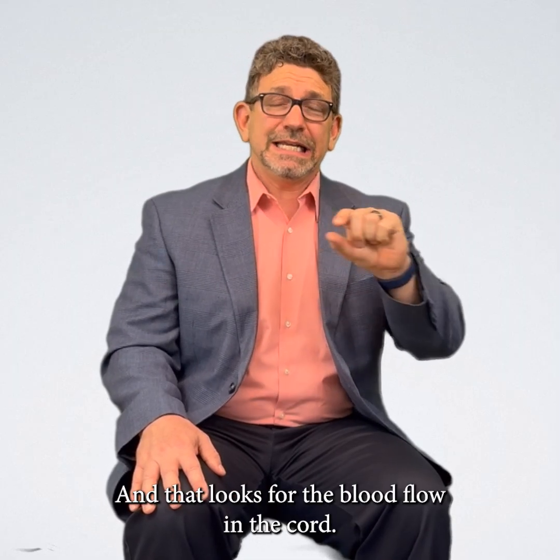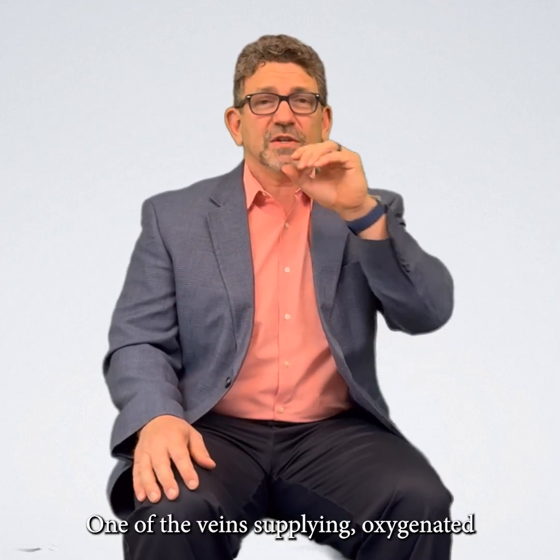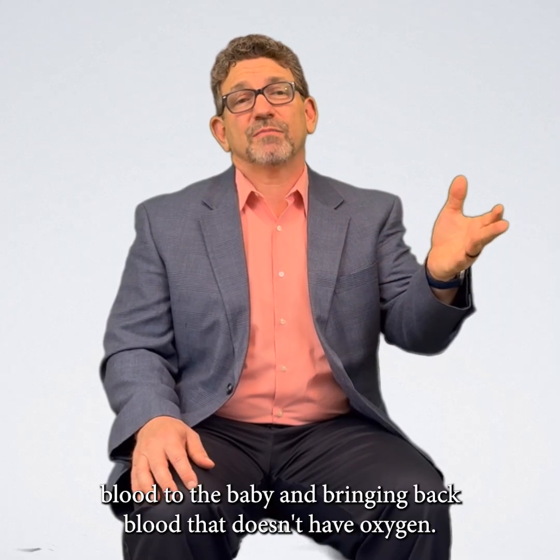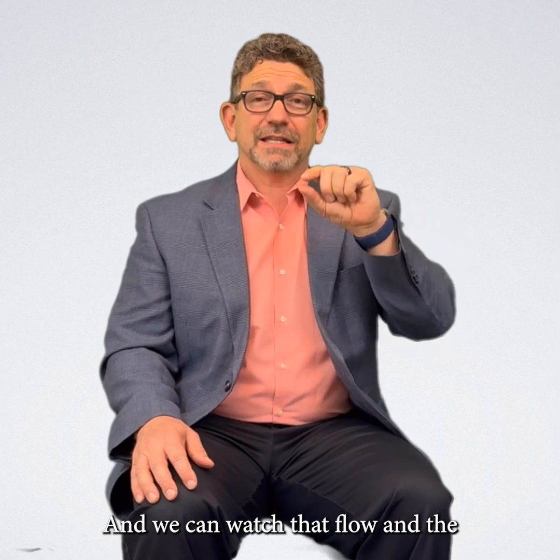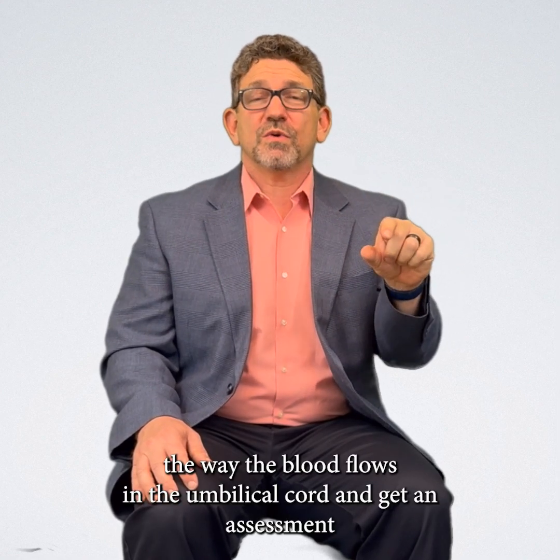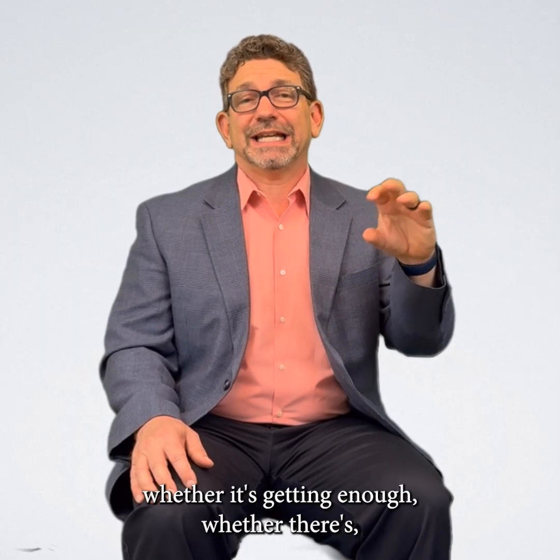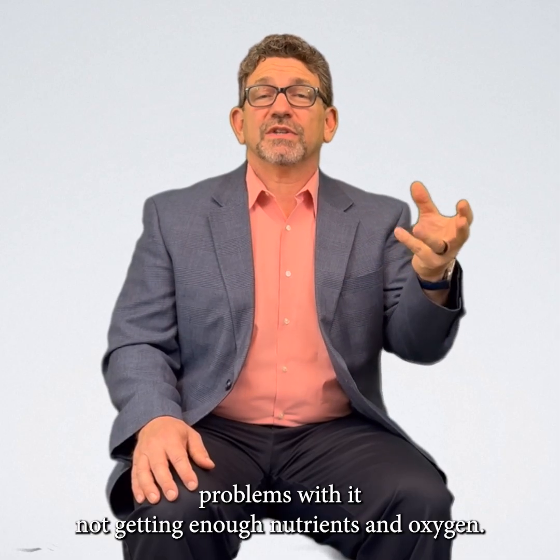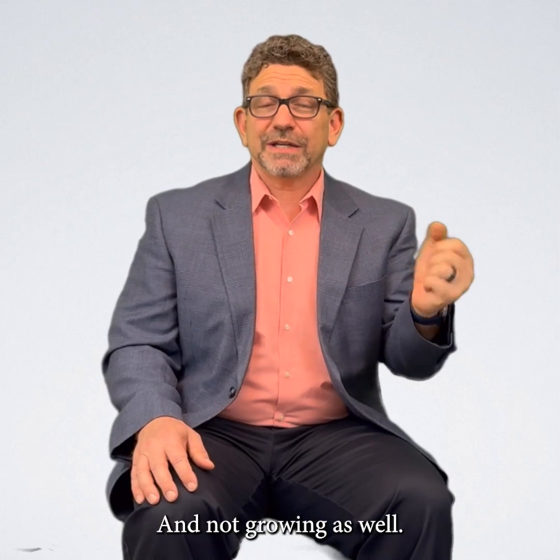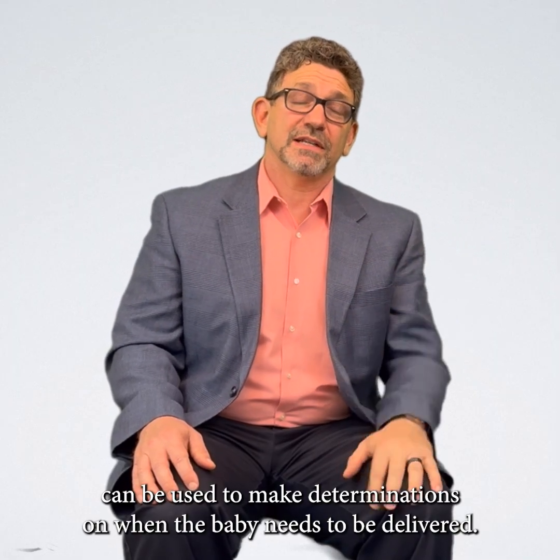Another assessment test for the baby, for the fetal well-being, is the Doppler test, and that looks for the blood flow in the cord. The blood goes in both directions in the arteries and veins, one direction in the artery, one in the vein, supplying oxygenated blood to the baby and bringing back blood that doesn't have oxygen in it. And we can watch that flow and the way the blood flows in the umbilical cord and get an assessment of how well the baby is doing, whether it's getting enough, whether there are problems with it not getting enough nutrients and oxygen, and not growing as well. And those can be used to make determinations on when the baby needs to be delivered.